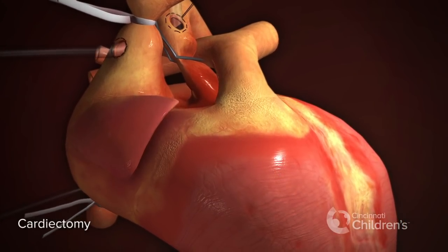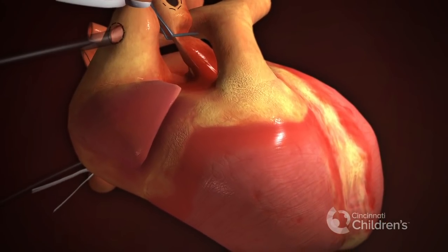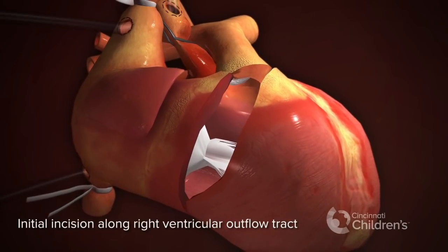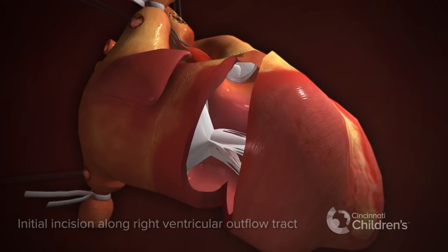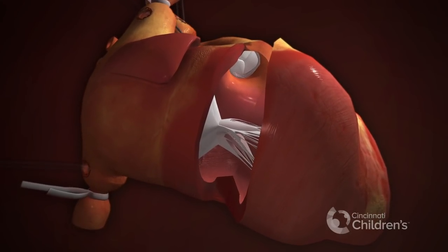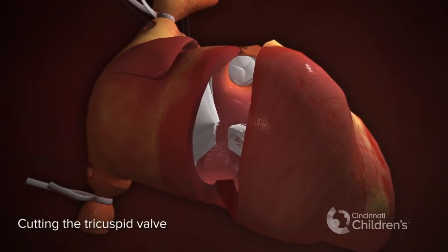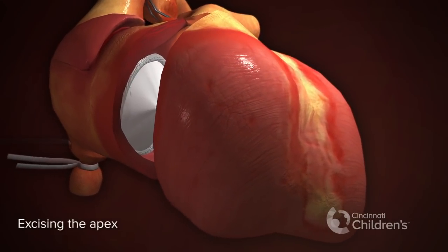Cardiectomy. Initial incision across the right ventricular outflow tract and parallel to the tricuspid valve annulus, leaving three to five millimeters of muscle rim. Cutting the tricuspid valve. Excising the apex.